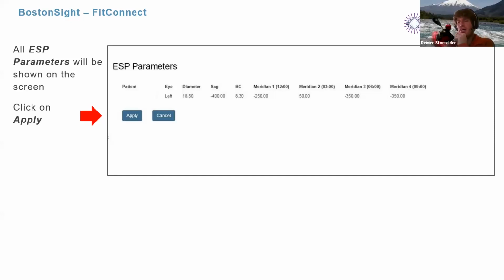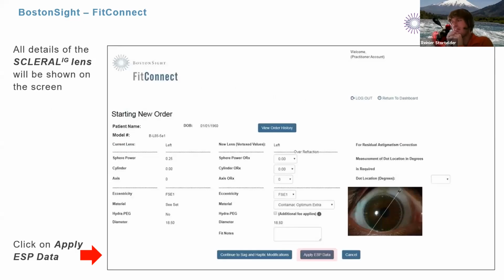And what would be your recommendation now during Corona? We try to avoid contamination. A lot of the practitioners are actually bypassing the application of that first trial lens. They are going with just the data and sending it completely empirically. Once they obtain that lens from the lab, then they use that to over-refract. So instead of one lens, it might take two lenses, but it bypasses the use of a trial lens, and it's still pretty efficient, right?